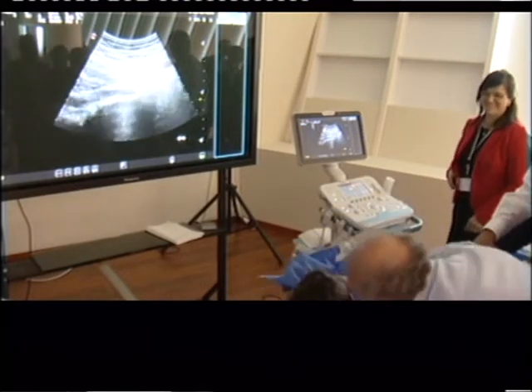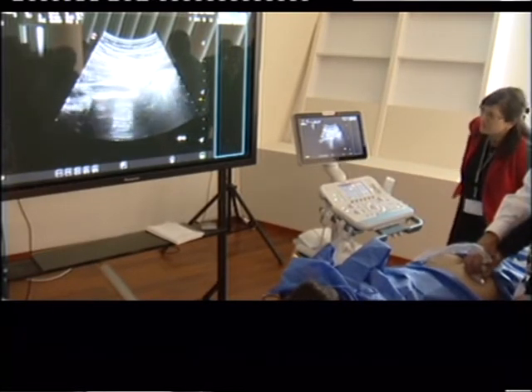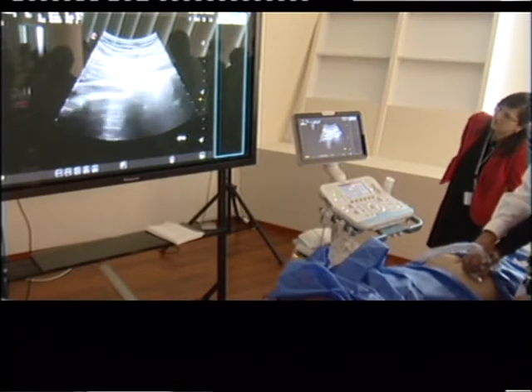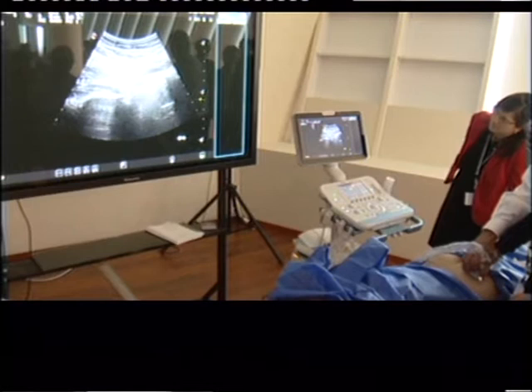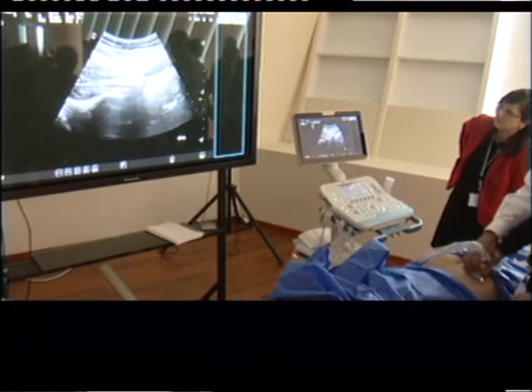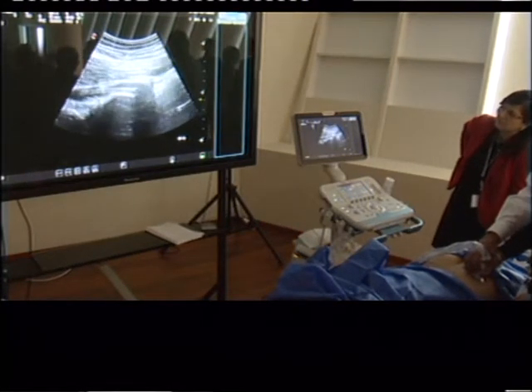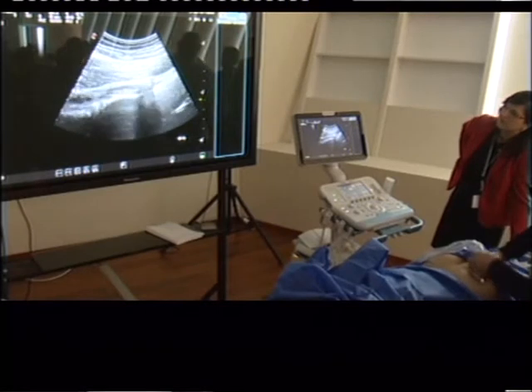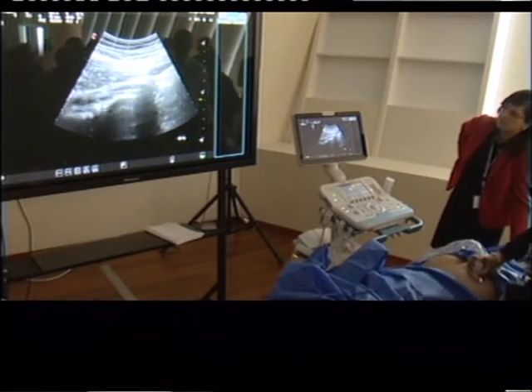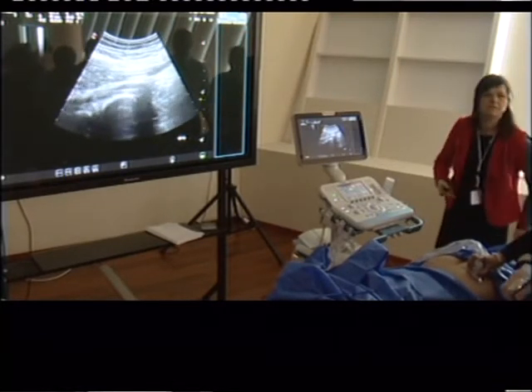Now pudendal, and you see it get flat. Sacrum, sacral spinous ligament, pudendal. Then here, obturator internus, the sciatic nerve. You hold it. I puncture from there and end up inside. Rotate the leg to make sure.